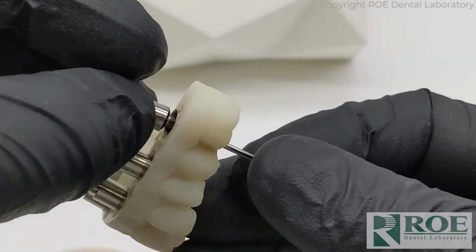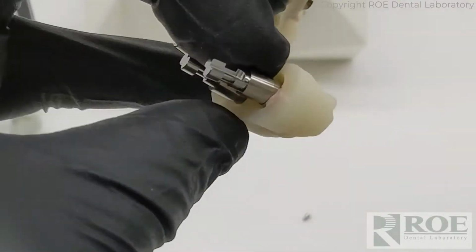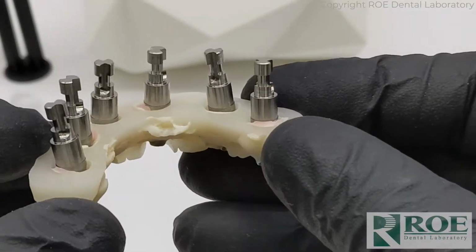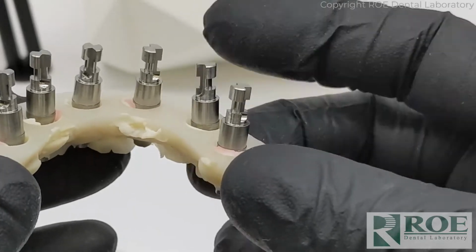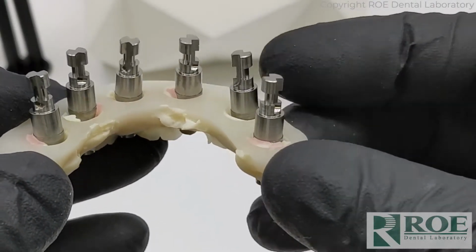Okay, got them almost all in now. Add the last one. One of the things that's important to observe is that these are fully seated, and you can see they are. You can see the seam between the abutment and the coping.